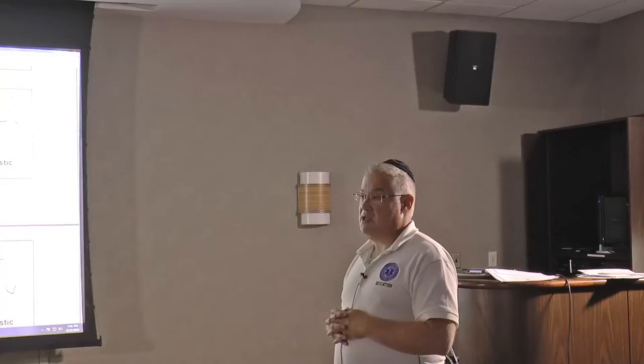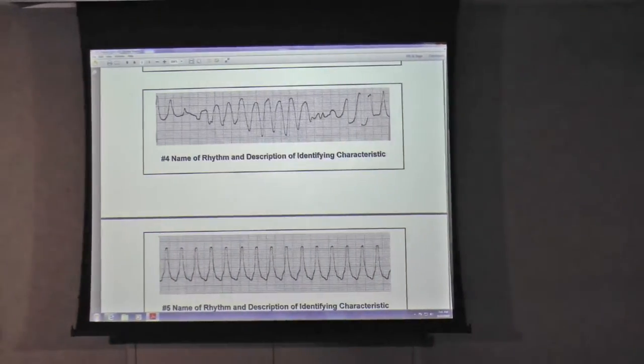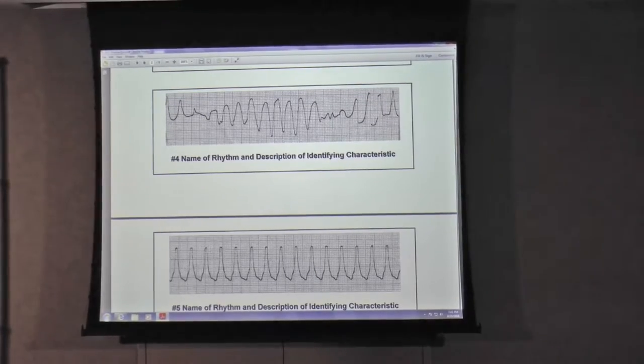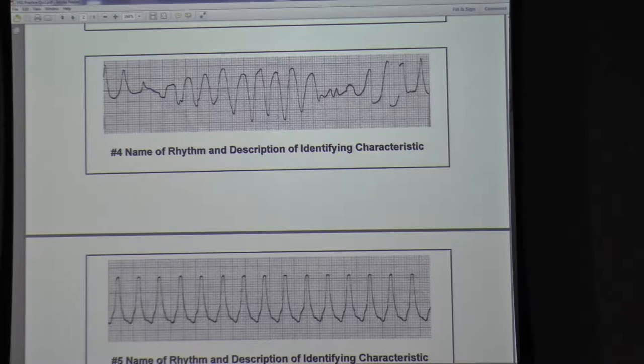This is probably either somebody who says to you, I've been having crushing chest pain for hours, feel like I'm going to die, or it's somebody maybe that you actually defibrillated, okay? They went back into a normal rhythm and then they're going back into the VFib, and this is what you might see before they go back into the VFib. So this is a very unstable rhythm.